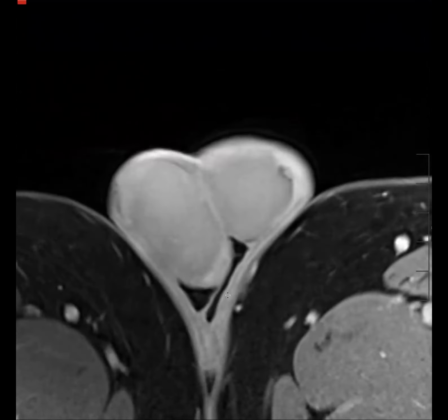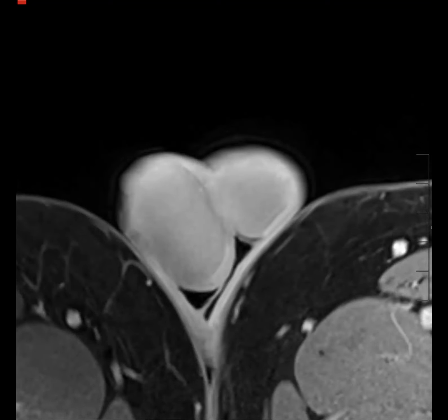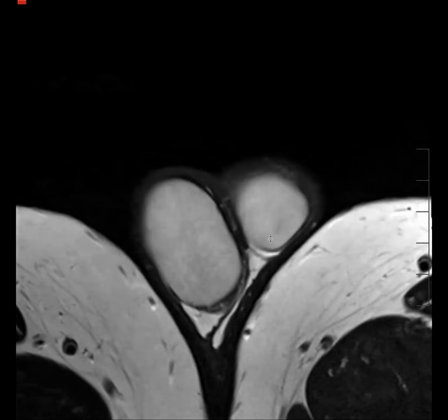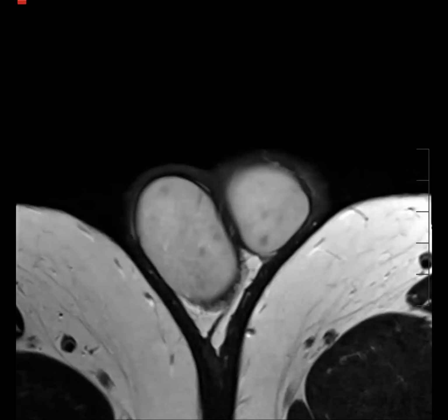Any thoughts? Here's your axial. So they're mostly standing out on the ultrasound and the T2. Yes. Here's your T2. On the T2, they almost look like granulomas or scars or something. Like right there, there's your T2. Very low signal. The fact that they don't enhance differently than the rest of the testicle makes me reassured that they're not malignancy. Did they have mumps, TB?